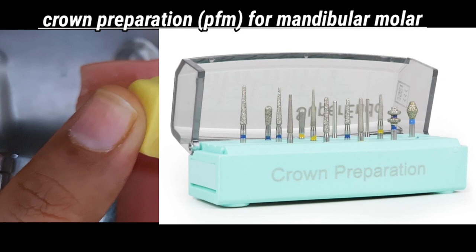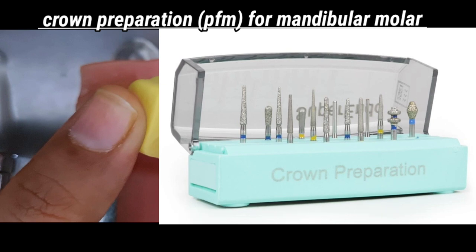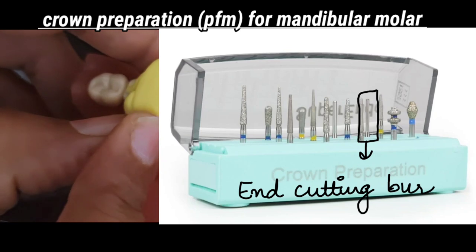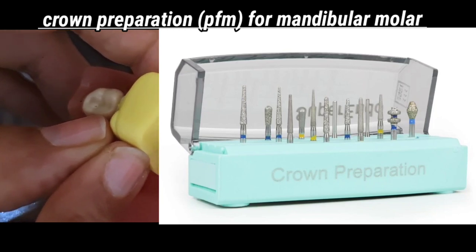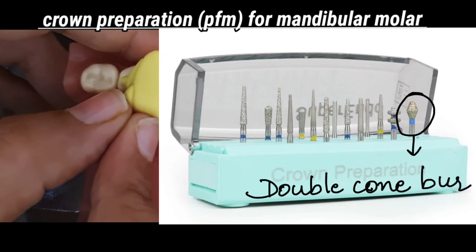You can also appreciate a small wheel diamond burr that is used for lingual reduction for a PFM as well as for all ceramic crown preparation. So this is a long needle burr, which is used for initial proximal reduction, and then we continue the proximal axial reduction with a short needle burr, which is relatively shorter. We have an end cutting burr for making a shoulder finish line, that is a gingival marginal line, and this is a double cone burr. A double cone burr is used for lingual or palatal surface reduction.